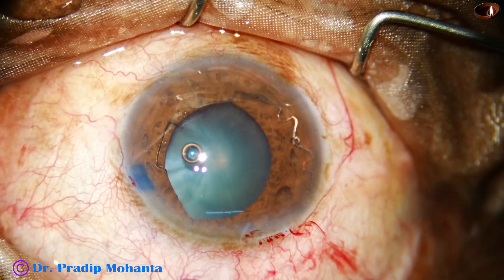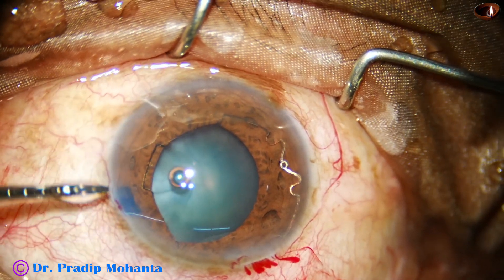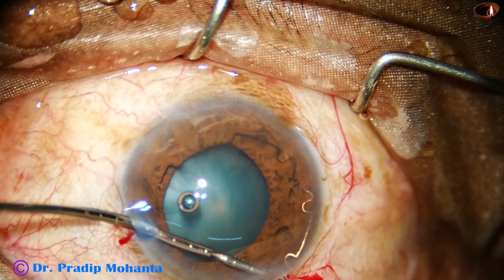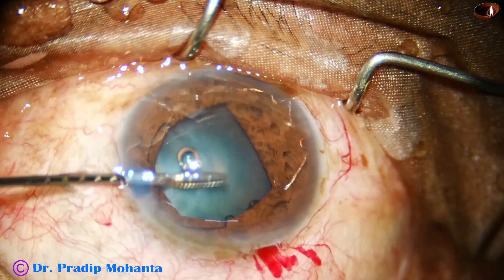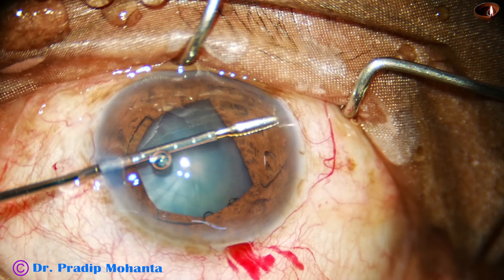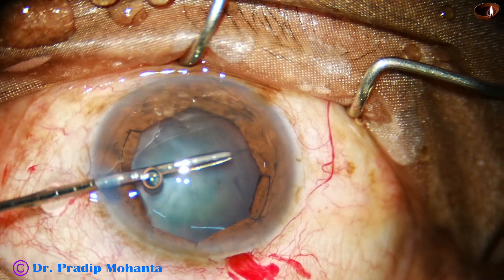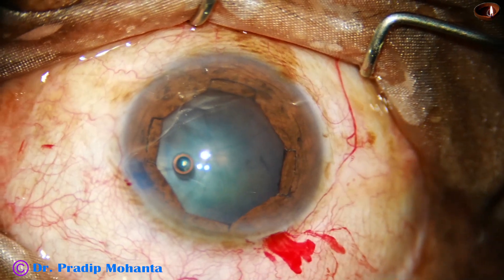With the Malyugin Ring you will get expansion of the pupil to about 6.5 mm, but with this one you will get expansion of about 7.5 to 8 mm. And the pupil will never shut down. It is a thin device and can be used in shallow anterior chamber. It will never touch the cornea.